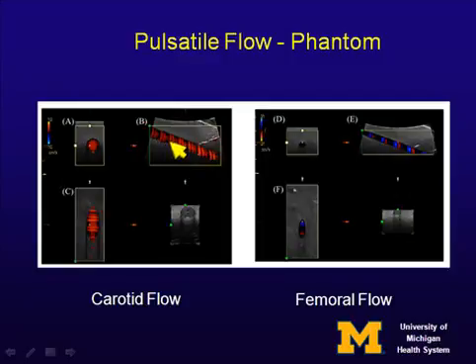So what we're seeing is the periodic flow in the tube. And in the C-scan, which is what we're interested in, this has exactly the same property. You can see there's high velocities and zeros and lower velocities. This doesn't matter if you want to measure average flow. And that's frankly what almost all the techniques that exist today measure.